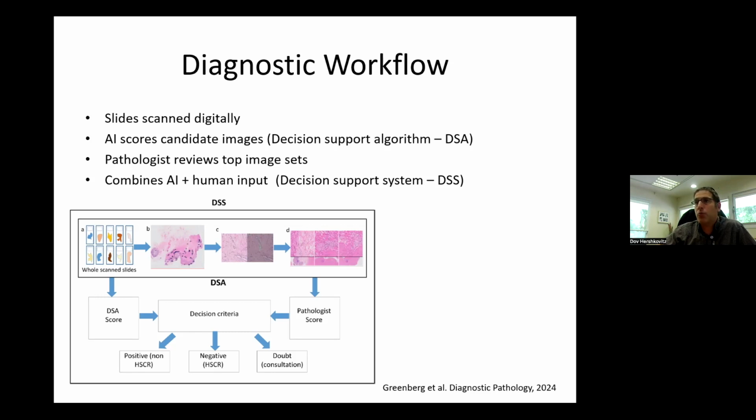Actually, there was even one case that was misdiagnosed, and we were able to find the patient recurred after a year, and actually the algorithm made a better diagnosis. Okay, so just the ganglion cells was enough to get to the same diagnosis in multiple hospitals as the pathologist did.